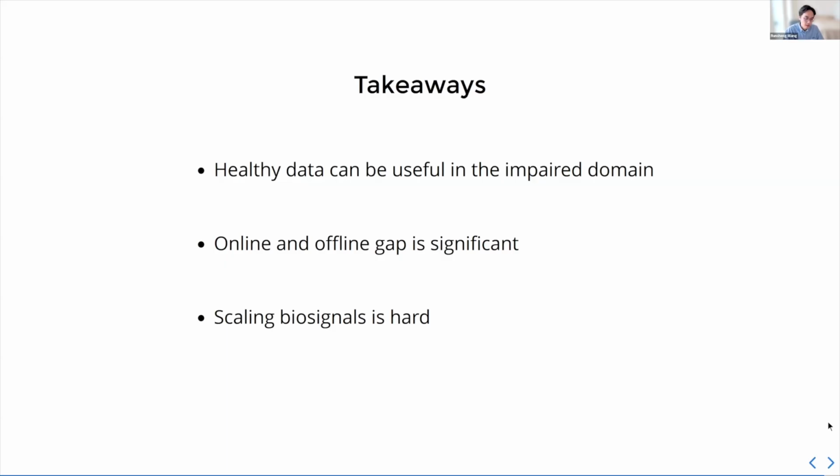And last but not least, scaling biosignals is very hard. And this is not just because of data collection issues, but also because the sensing interface is not standardized, right? So there's a lot of EMG sensors out there. Many labs are developing really good sensors, such as high density EMG grids, or fabric EMG sensors with conductive fabrics.